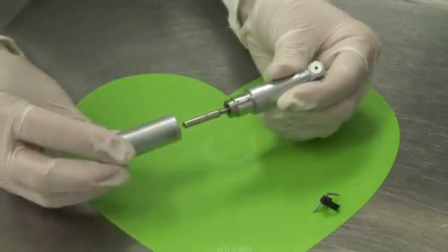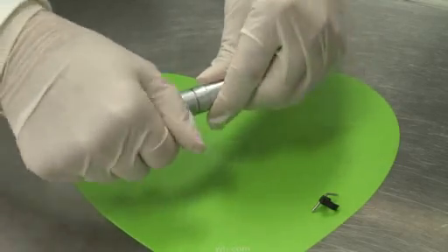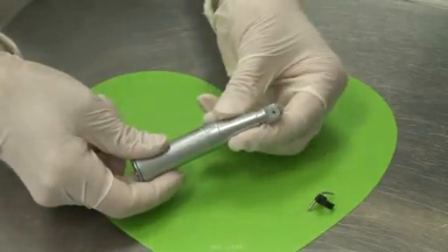Then the sheath — opposite of when you took it off — twist away from yourself to lock in place.